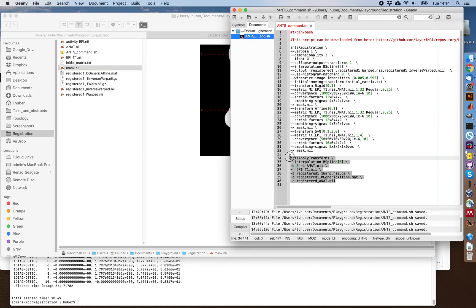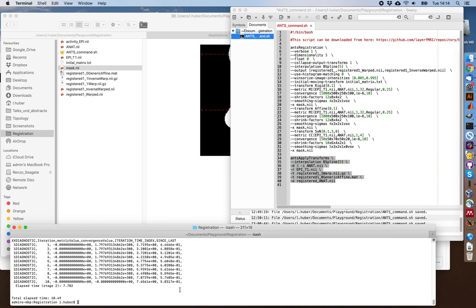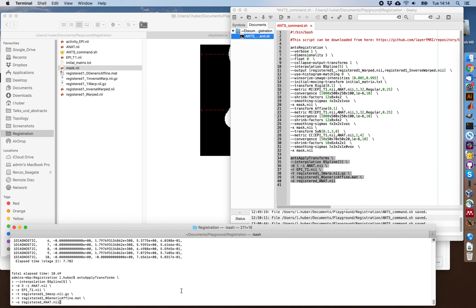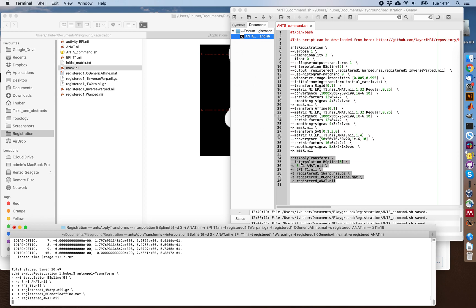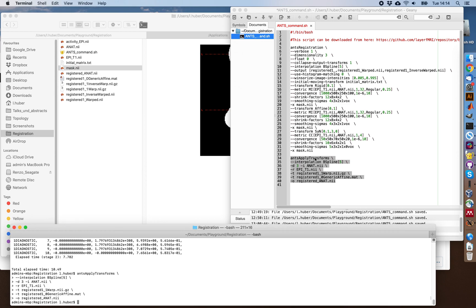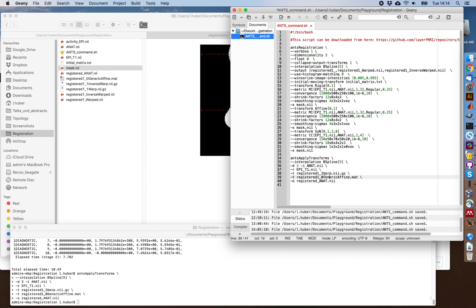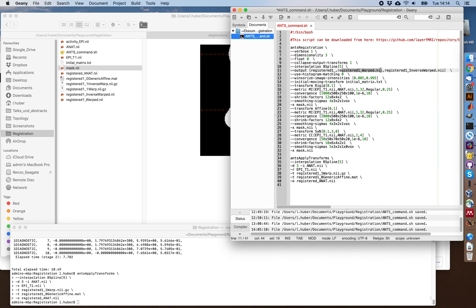At the end, I also want to show you that you can easily use the same transformation that ANTs calculated here and apply to another dataset. For example, with this command with ANTs apply transformation, where you give it the same matrix and warp field that was calculated earlier up here. Check out the comments below. Thank you.